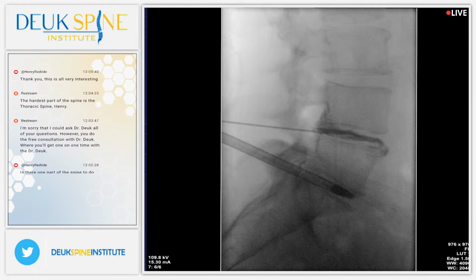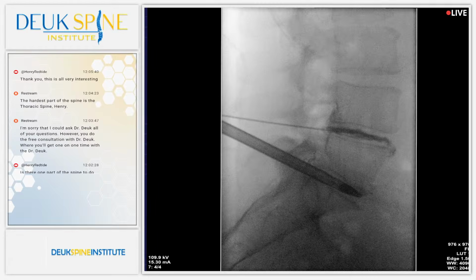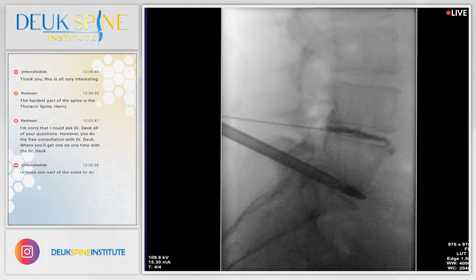I've just entered the L5-S1 disc on the left side through the tear that was already there. That's the tear that's causing all of her pain at the L5-S1 level. We're going to clean that tear up right now using a laser and an endoscope.